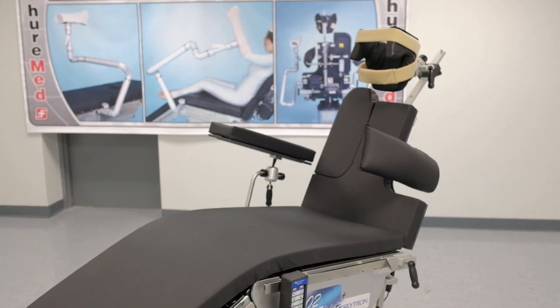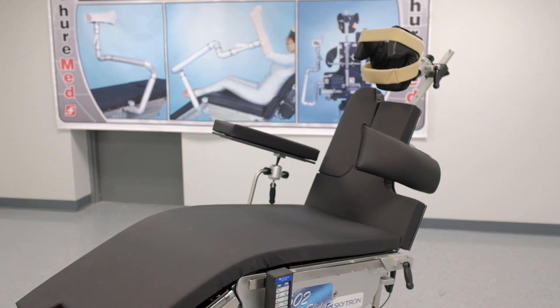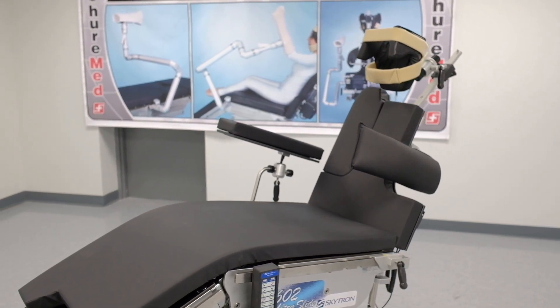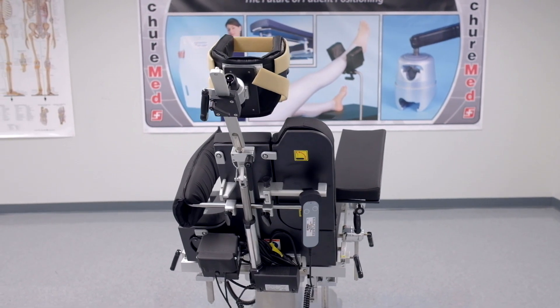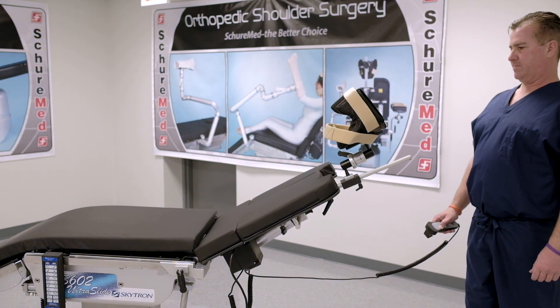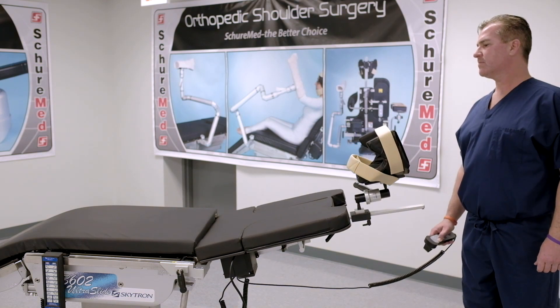Today we are reviewing the Powered Beach Chair. It's the only powered surgical beach chair on the market with a self-contained motor that keeps the patient and the operating room staff safer. The Powered Beach Chair securely supports patients up to 500 pounds with an articulation range from 0 to 90 degrees in an 8-second controlled movement.